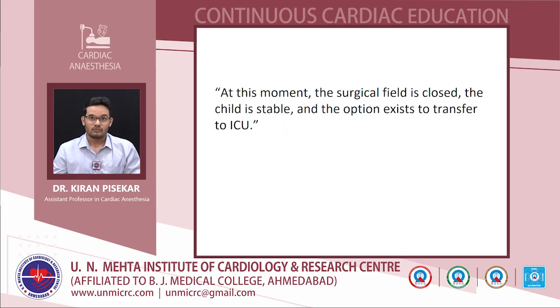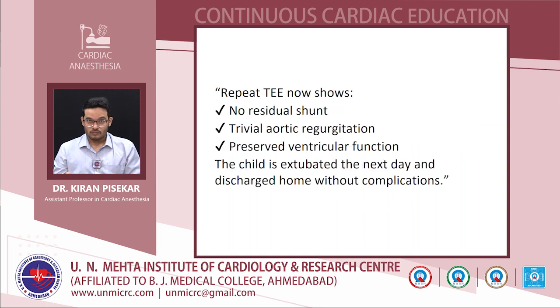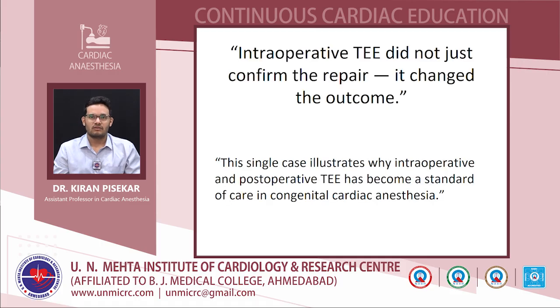So now the plan is changed. At this moment the surgeons were ready to close, but now because of the TEE finding, the decision is made to return on CPB and the VSD patch is revised and the aortic cusp is resuspended. Again the patient came off smoothly, no issues. On repeat TEE we find no residual shunt, trivial aortic regurgitation and preserved ventricular function. So intraoperative TEE not only confirmed the repair, but it changed the outcome of the patient.